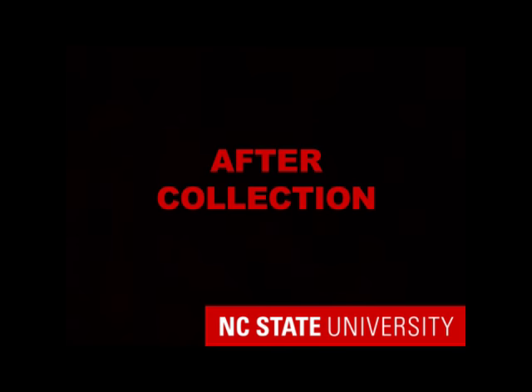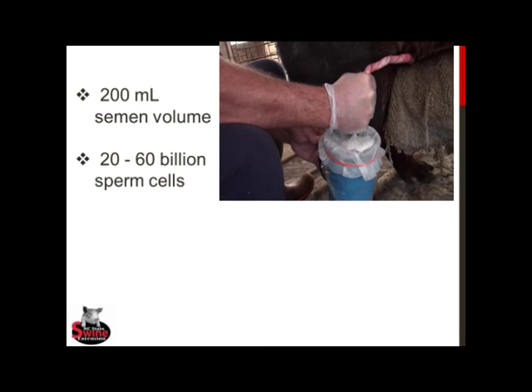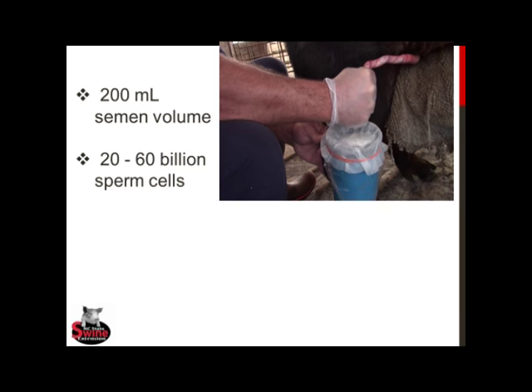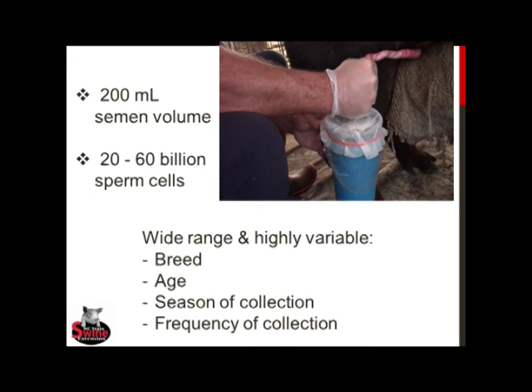After collecting the boar, we'll head back into the lab to extend the semen. Producers looking to learn more about proper semen collection procedures can do so by viewing our video, Boar Training and Collection. A link to this video is provided in the video description below. Typically, an adult Western breed boar will produce about 200 milliliters of semen containing anywhere from 20 to 60 billion sperm cells. However, the volume and number of sperm may vary considerably according to the breed, age, season of collection, and the frequency at which the boar is collected.